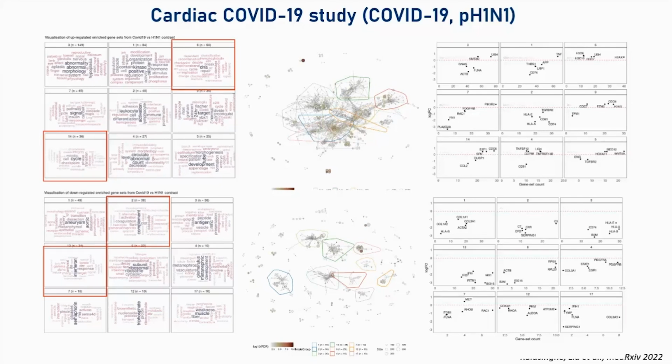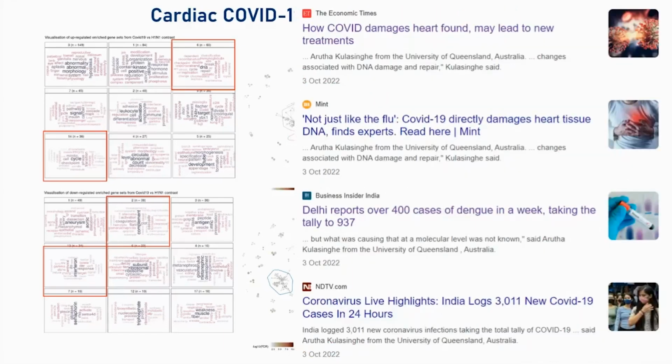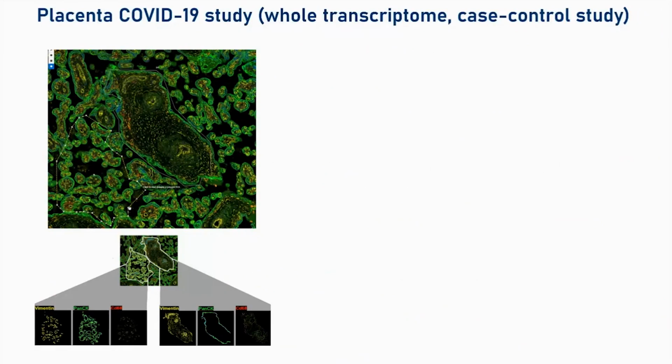We then went on and stained the tissues using broad DNA damage markers, using gamma H2AX and a few other markers at the protein level, and we could see that staining was specific for the COVID-19 cohort, and not the flu, not the 2009 flu pandemic cohort. So again, a pinch of salt. This is at severe stages of disease in an unvaccinated population. This work was showcased around the world in a number of studies. And so I'll go on to the last study before I conclude this talk.